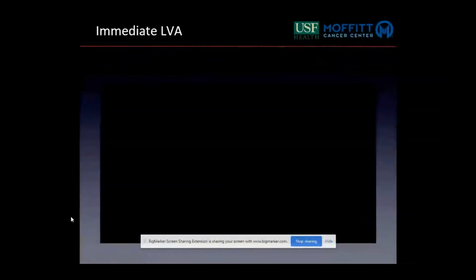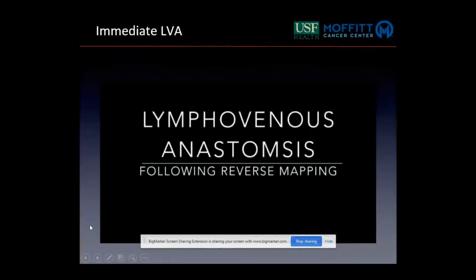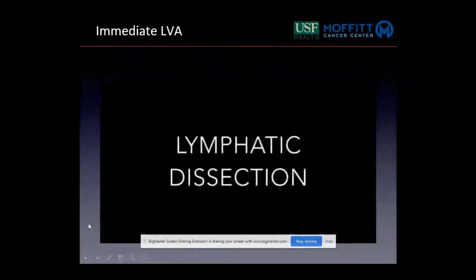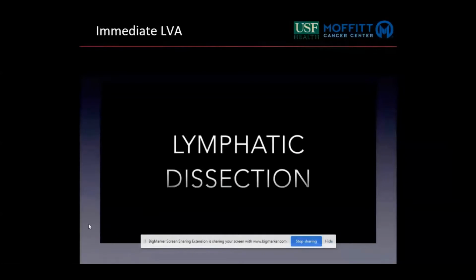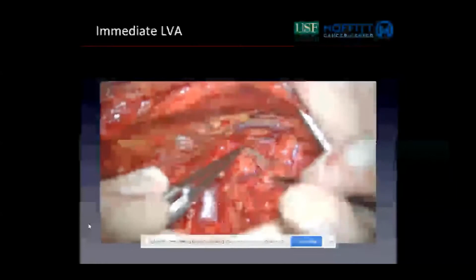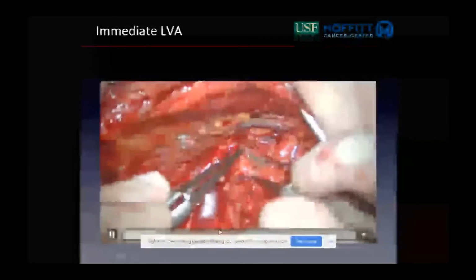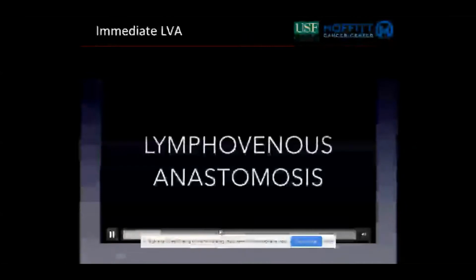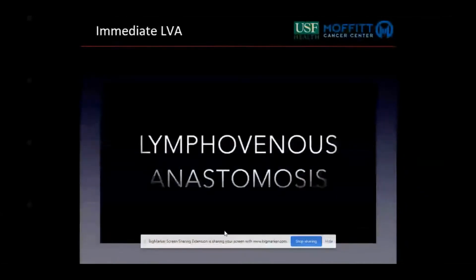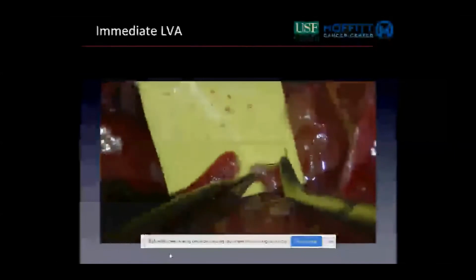So we can briefly look through this, and I'll fast forward, but really it's a very similar principle that was applied to established disease: lymph node lymphovenous anastomosis for lymphatic reconstruction at the time of nodal extirpation. This is the dissection out of an axillary draining lymph node at the time of axillary lymph node dissection. So it again is isolated. A recipient vein is identified in the axilla. And again, a microsurgical anastomosis is performed to reconstitute lymphatic outflow from that extremity.